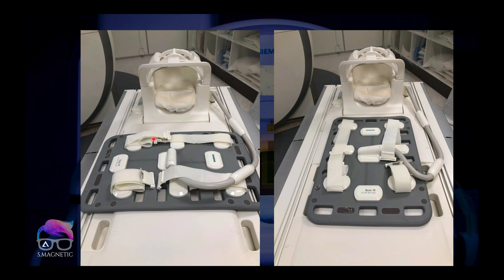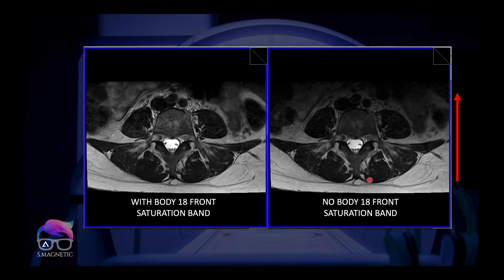I position the coil in portrait orientation, not landscape, just placing it on the stomach and making sure all leads are okay. Then I position the patient and continue with the exam - it's very fast and efficient. There's no excuse to skip it. You saw the images - it makes a whole difference in image quality. Be the radiographer who wants to deliver good images and be proud of that.